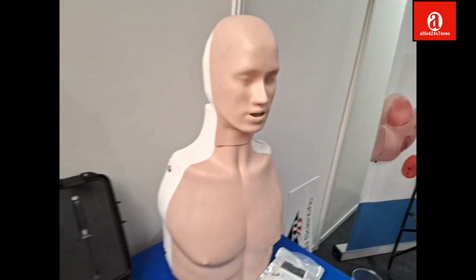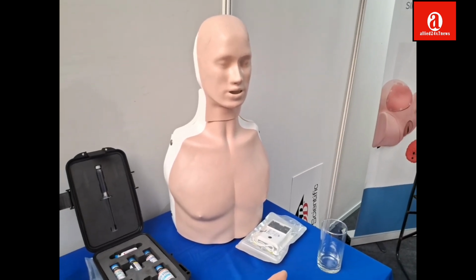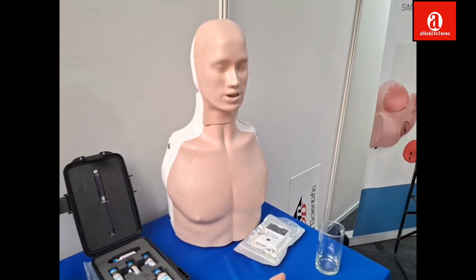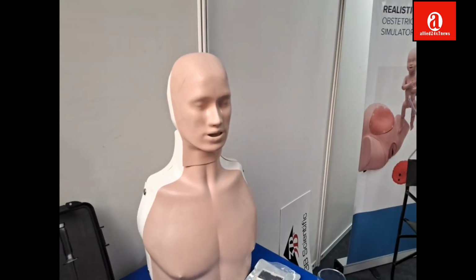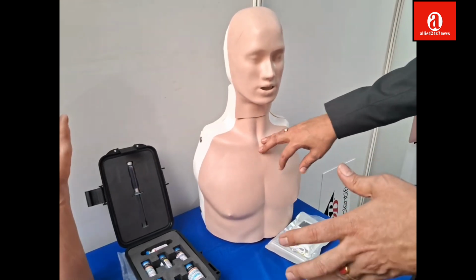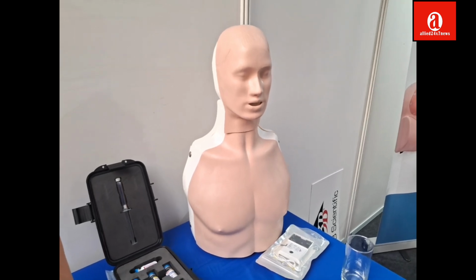This one we have is the basic CPR for basic life support, and automated electrical defibrillation training. It's again an emergency training procedure used by every medical and healthcare worker. This is the basic, where all of them start together to save a person from a heart attack, and how we save them until a qualified ambulance arrives.